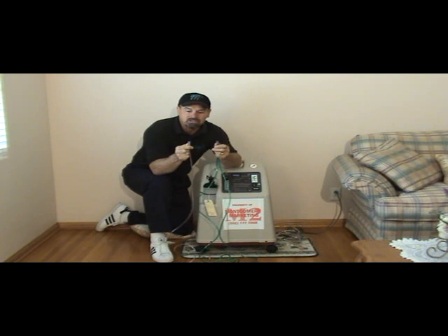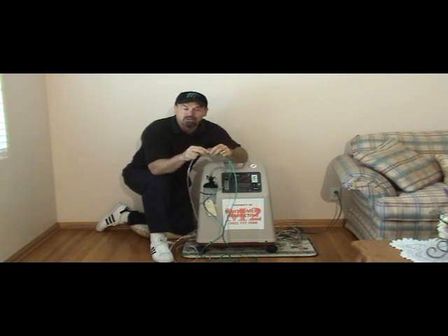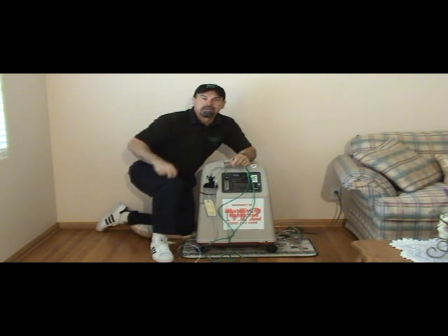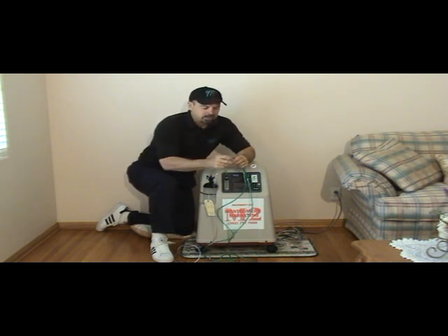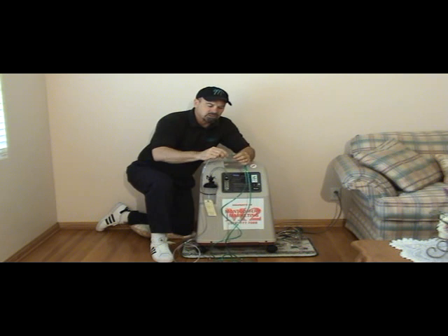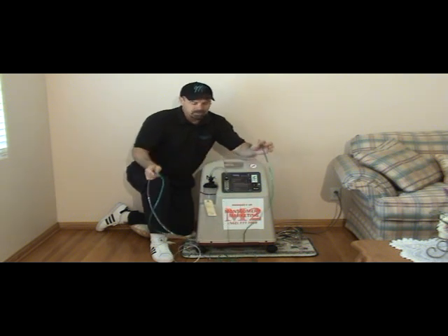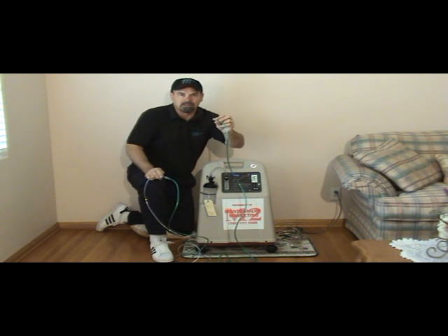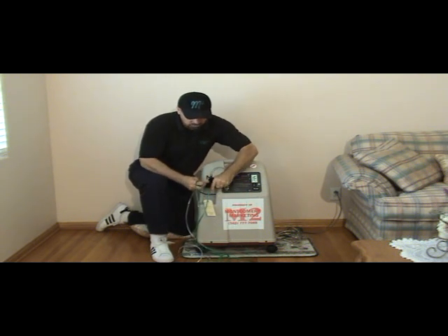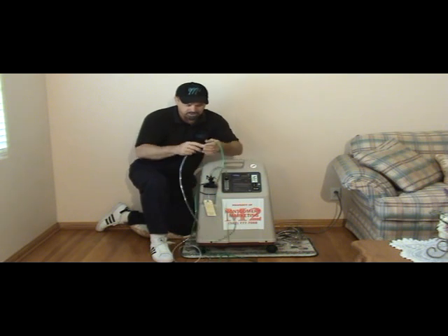Obviously, since the ends are the same, they're not going to hook into each other. So there's a little piece called a connector that has 2 male ends on it. One of the male ends goes into one end of the extended tubing, and the other end goes into your nasal cannula or mask. Then the opposite end of the extended tubing hooks on to the humidifier bottle or to the concentrator.